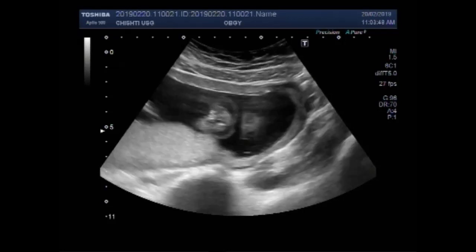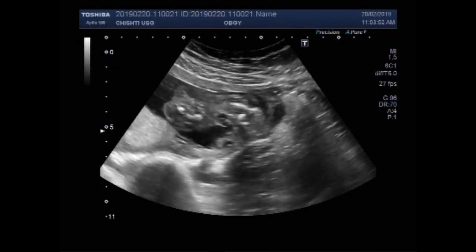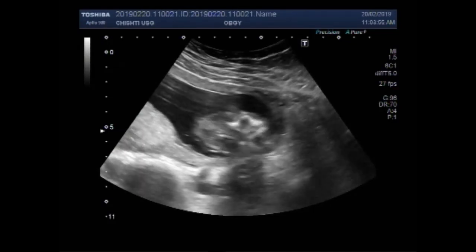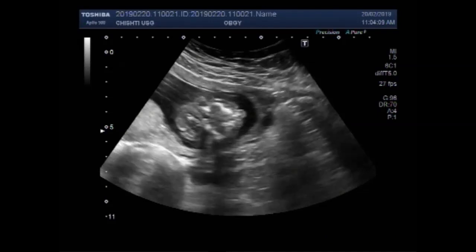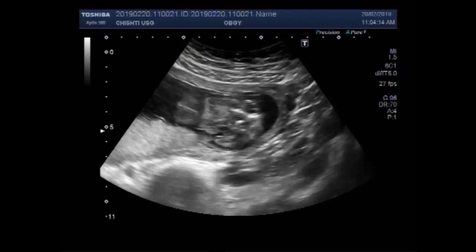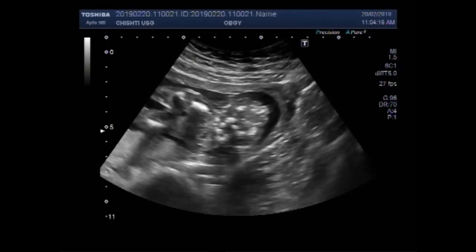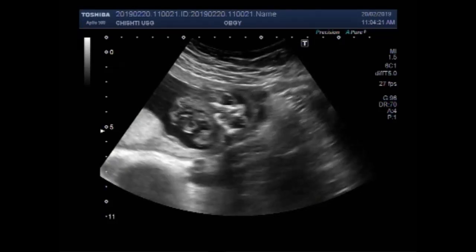You can see in this case the fetal cardiac movements and fetal activity is visible, but you can see the skull is missing and only the eyes of the fetus are visible. This is the brain matter. And you can see the skull is missing.